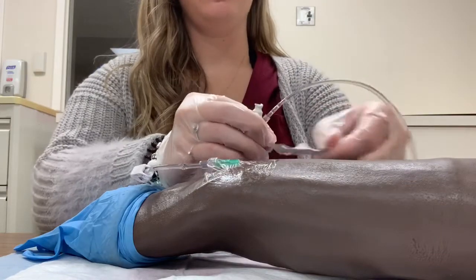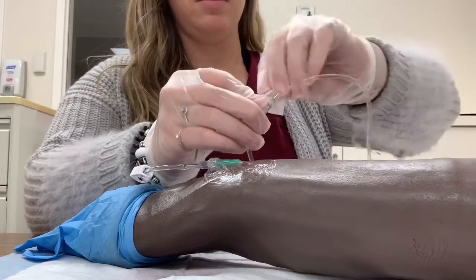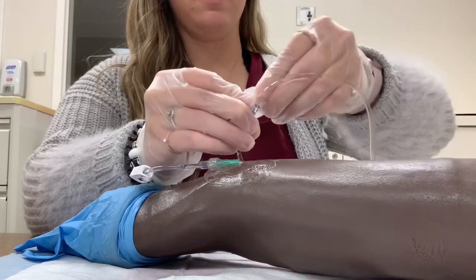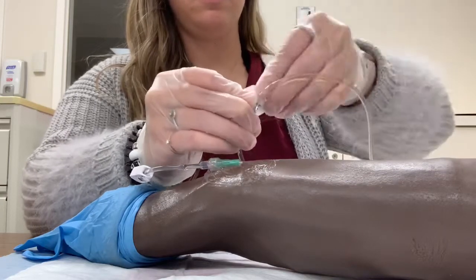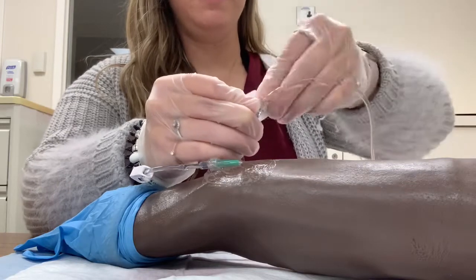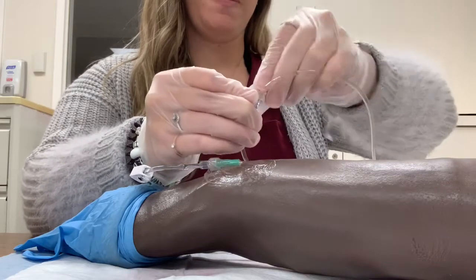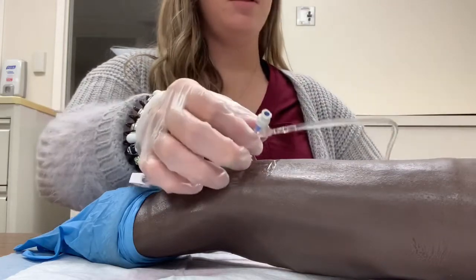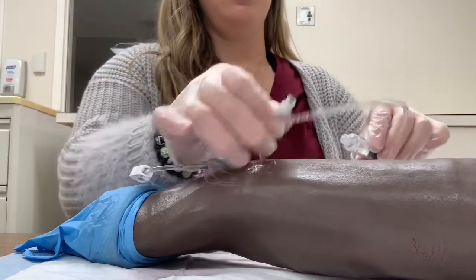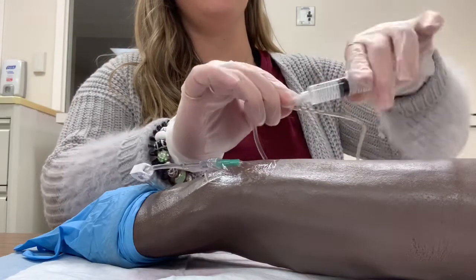I will take another alcohol swab and alcohol it off for 15 seconds, then let that dry. I would then take my normal saline flush, connect it, and flush two milliliters.